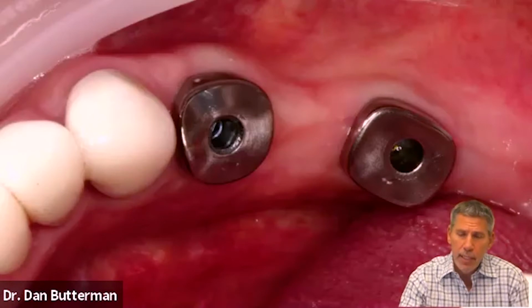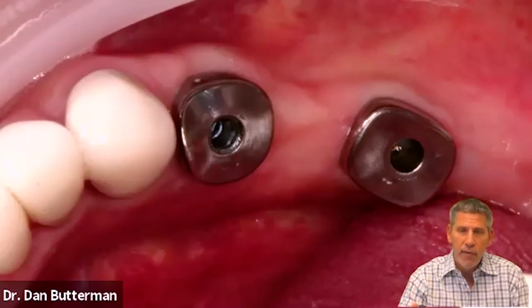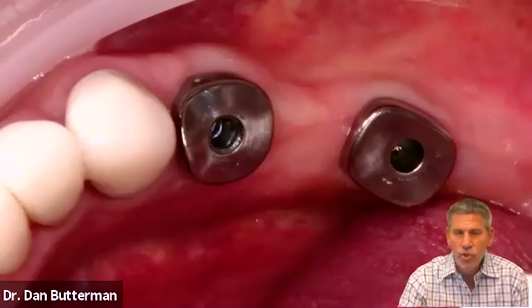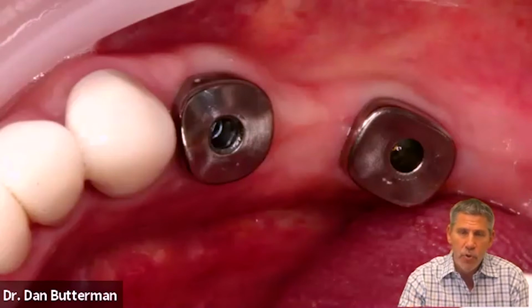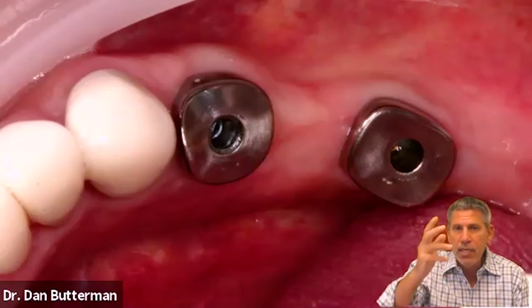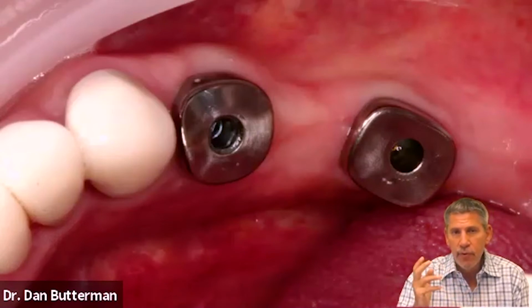So the patient comes back, and this was after they fully healed, but they come back for their post-op where I'm removing the sutures, and I'm just very carefully taking off one and tightening these into place. It's been short enough time that we're still not getting bone remodeling within the first week. So I'm not worried, because these implants torqued in quite well. I'm not worried about putting a little bit of rotational pressure on these because they still have primary stability. They haven't lost that. We haven't had that dip that happens at about 2 to 3 weeks when we start shifting from mechanical stability to osseointegration.